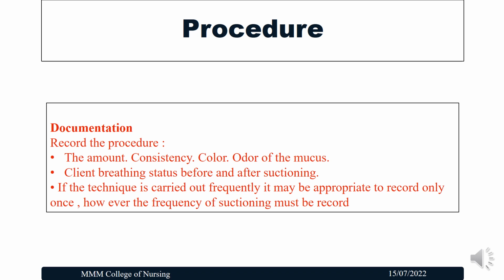Sometimes we will do suctioning 3 or 4 times, but when we are doing suctioning, make sure that we do not suction for more than 10 seconds. If you want to repeat it, wait for 1 minute and then we can apply the suction again. If the technique is carried out multiple times, there is no need to document each time as 1 time, 2 times. Instead, we can mention how many times we have done the suctioning.